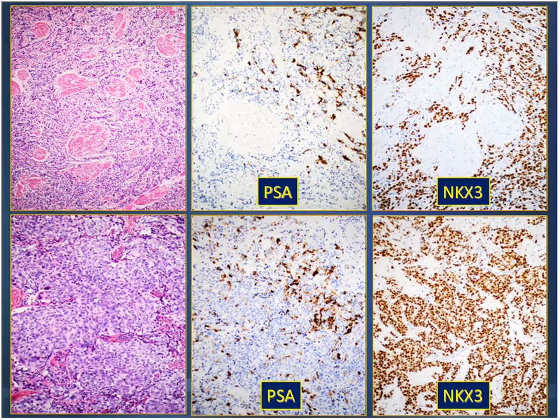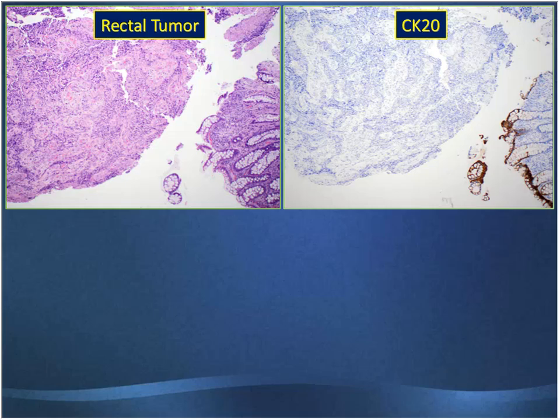and is also very helpful in metastatic areas, such as this case, which was a rectal tumor, and it showed a poorly differentiated carcinoma in the rectum, which in a male, I always tell our residents to think about as an extension of a primary prostate to rectum, and of course, this kind of poorly differentiated tumor could be of colonic origin.